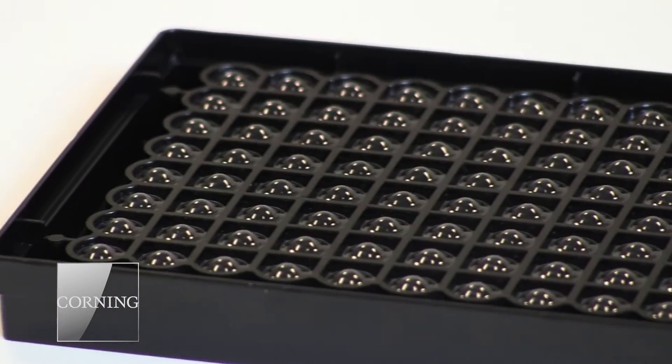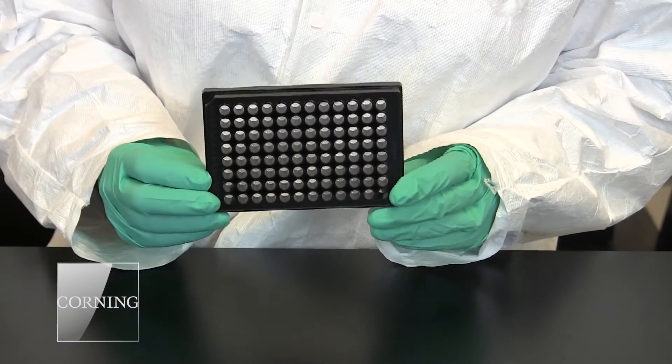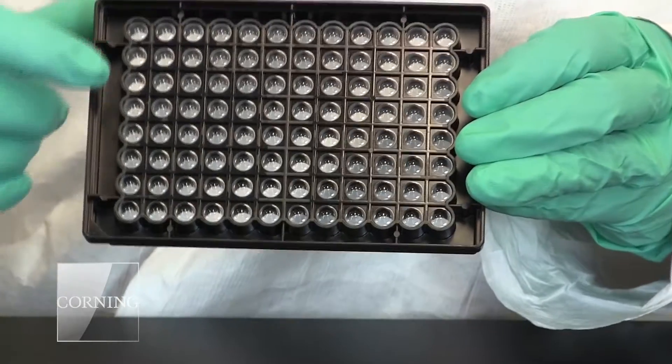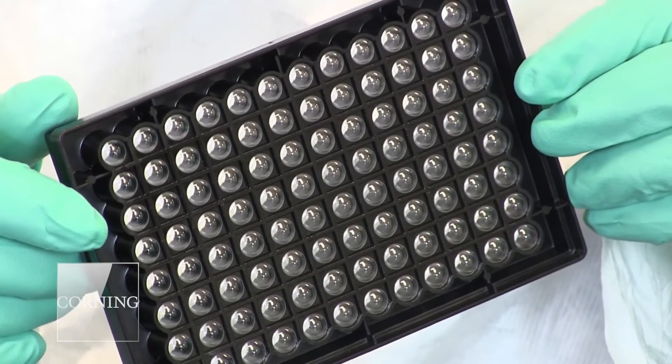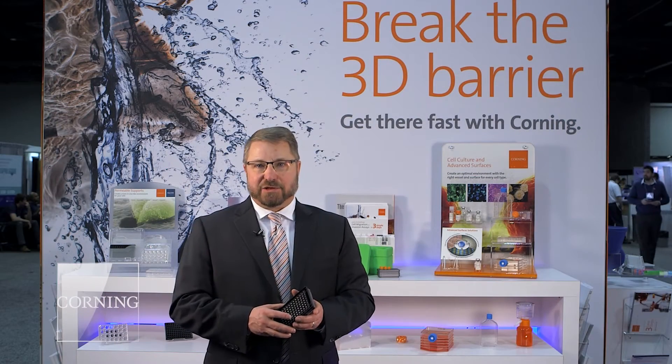What we launched a couple years ago and talked about last year was our spheroid microplate. This is a simple 96 or 384 well microplate that allows the customer to, in a single plate, form their spheroids and also run assays in that same plate without having to do a transfer step or a media exchange.